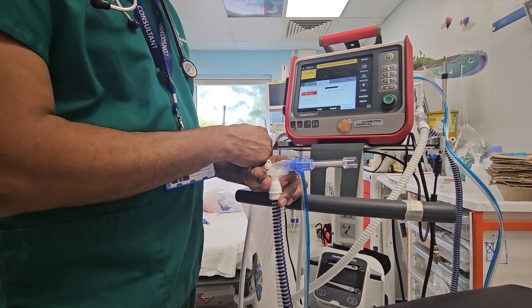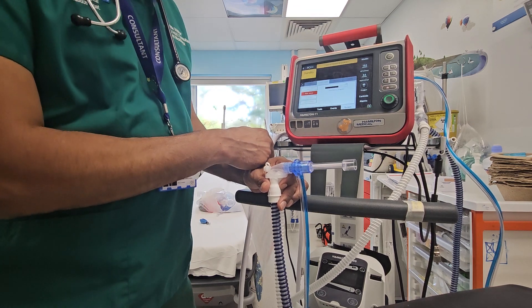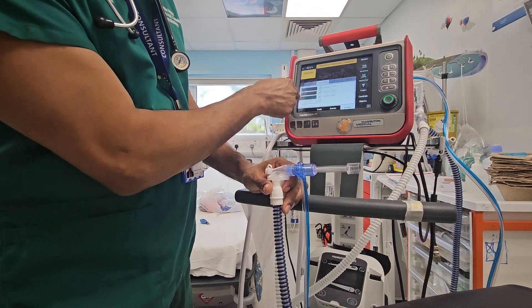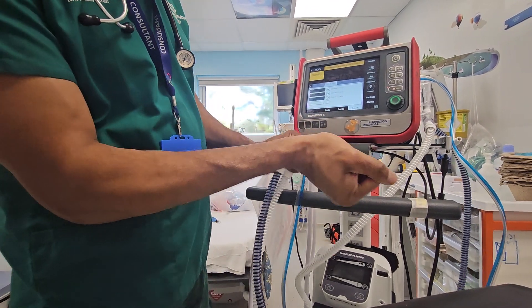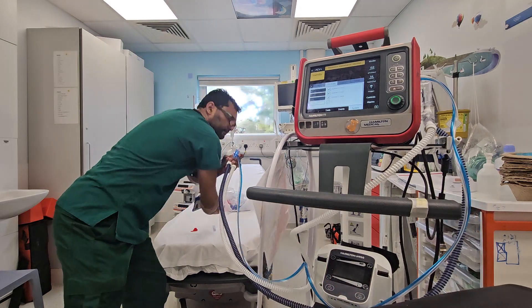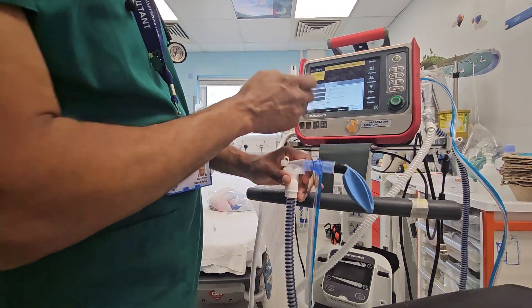Everything is ticked now — calibration is all done. Remove this, and I am going to attach a test lung just to make sure we are doing the correct thing.